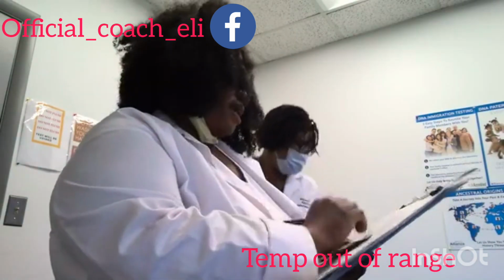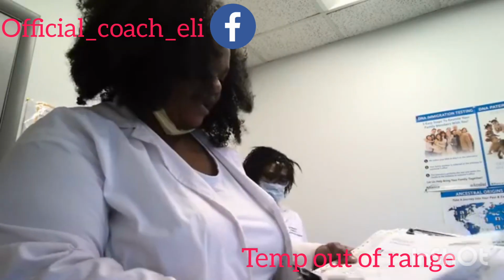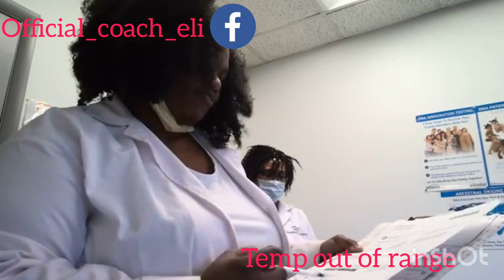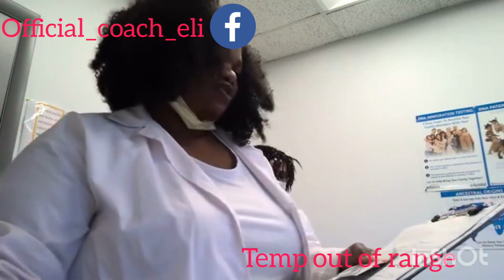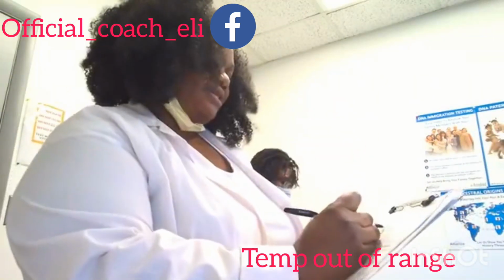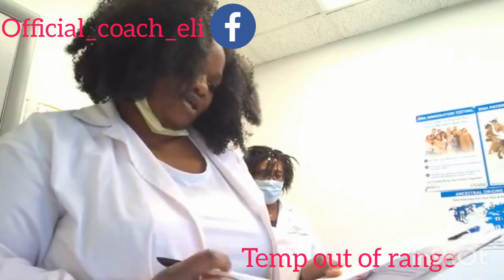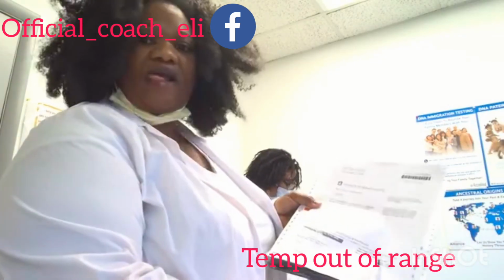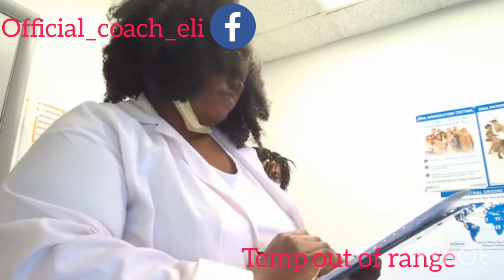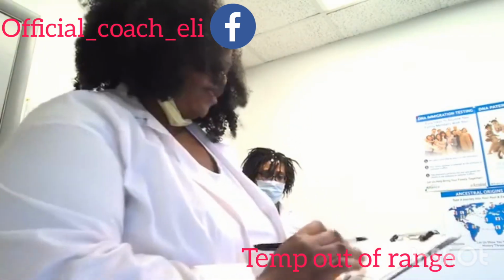All right. And where is the special authority? I'm going to go to my authorization form to get that. Okay, she is from National Account. She's from the staffing agency, so we're going to say she's from the FMCSA. I'm going to go ahead and check FMCSA. What is the reason for the test? This is for pre-employment, so I'm going to check off pre-employment. And it's always going to be 5 panel for DOT, so I'm going to check the 5 panel.